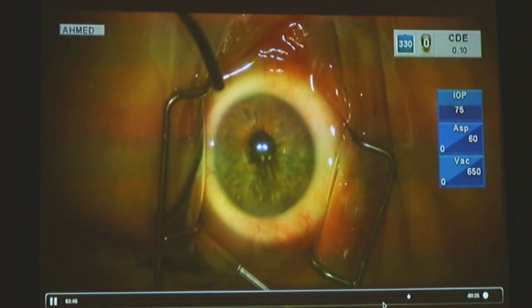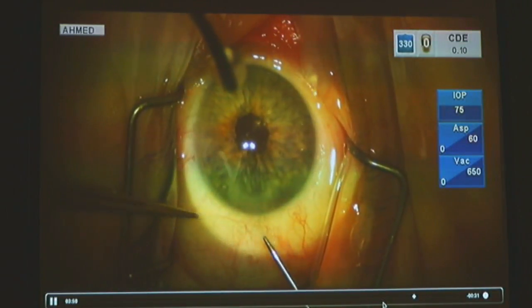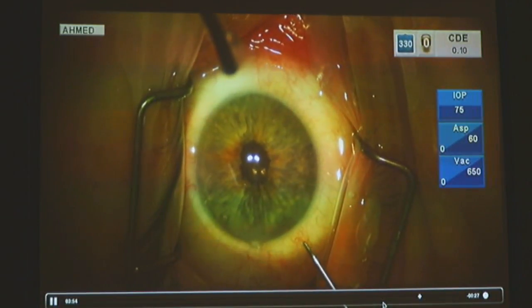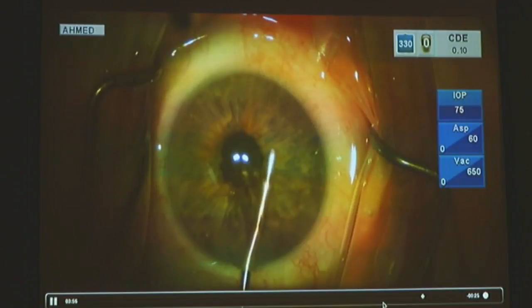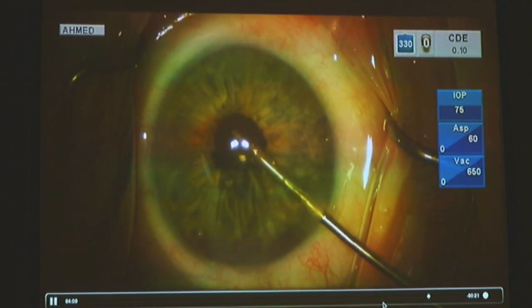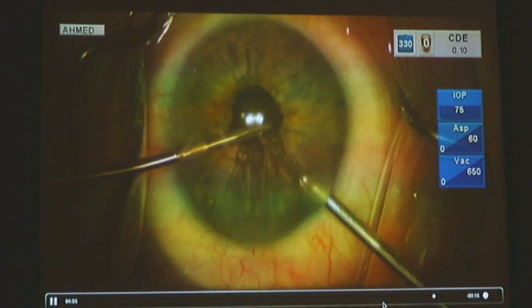This is a good balance between mesopic and scotopic. Our retina surgeons don't like us because they like to get a big pupil, but they can still look around with depression and a Goldmann lens, and if they have to do surgery, they can use a BIOM, a wide-angle view system, and they usually can do okay with this. But if they don't, I just tell them, cut the suture or put iris hooks in.